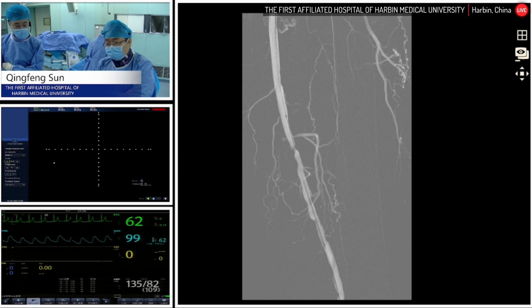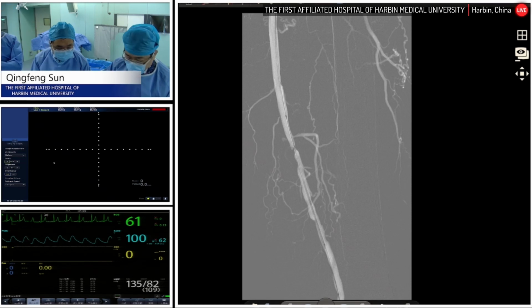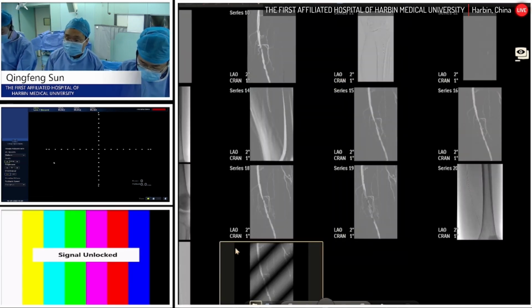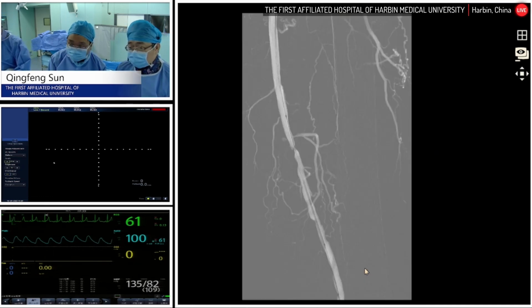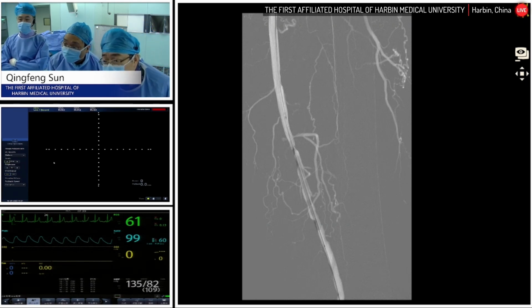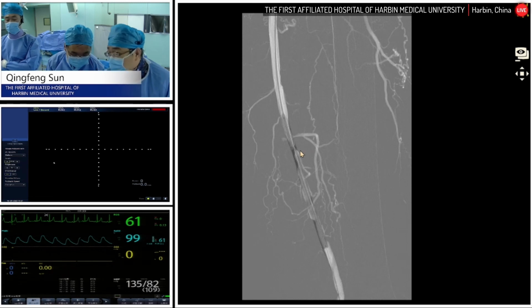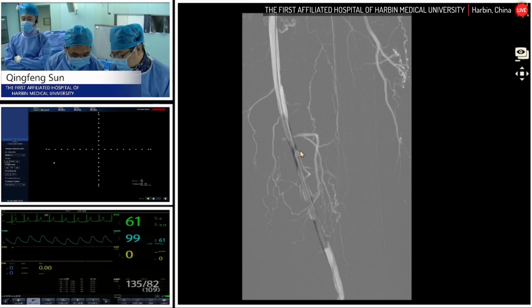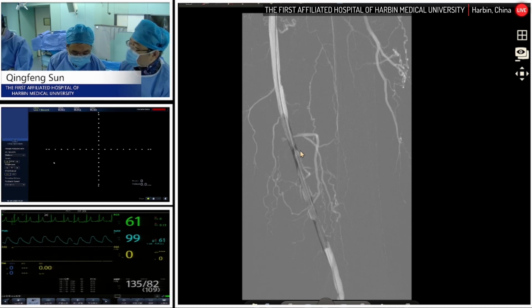And here we go. We have the 5 millimeter Sterling balloon to the lesion. Nominal is 6. Here we go. Oh, there is still some stenosis. We can see that from the expansion. Okay, for like 3 minutes. Nominal is 6. Yeah, there we go.